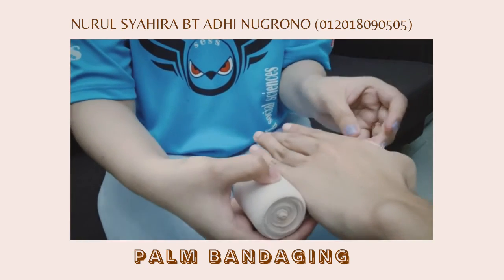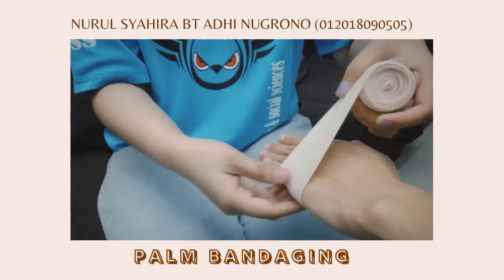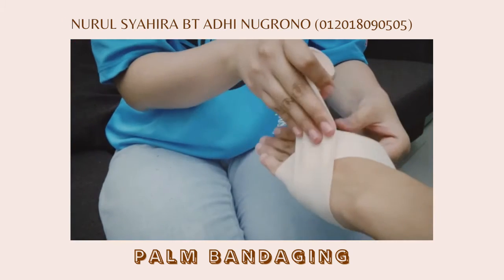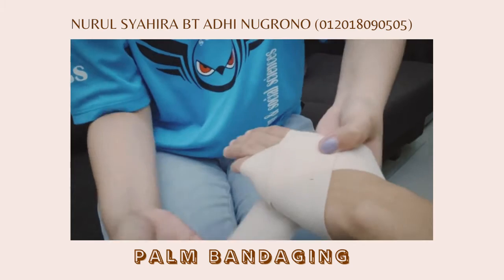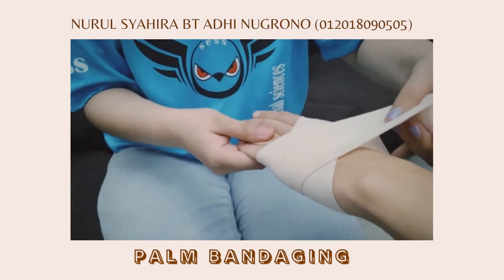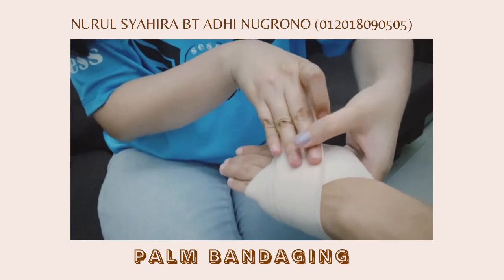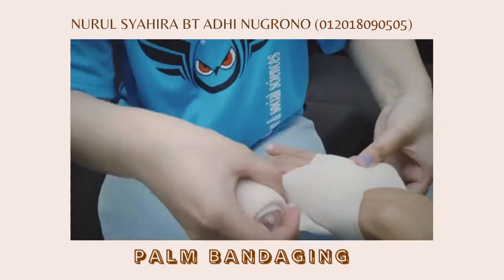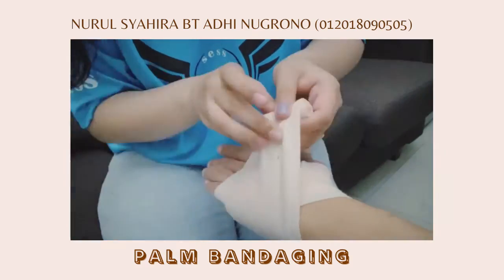Take an elastic bandage using the patient's thumb to hold the end of the bandage. Then cross it over your hand. And do it again until you create a cross. Repeat the cross, which will then create a spiral effect. Make sure that the spiral effects are parallel with each other. Repeat the cross until the bandage is complete.